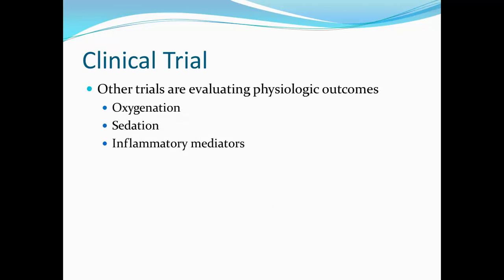There are other trials that are underway now that are currently recruiting patients. However, the primary outcomes for those are looking at oxygenation, sedation, and inflammatory mediators. While these are important, I'm surprised that none of those include a primary outcome of mortality.